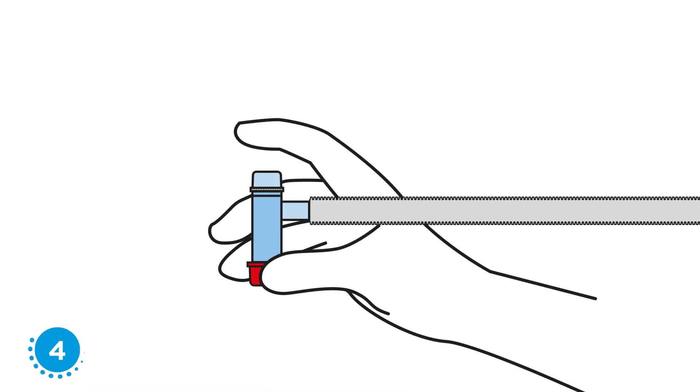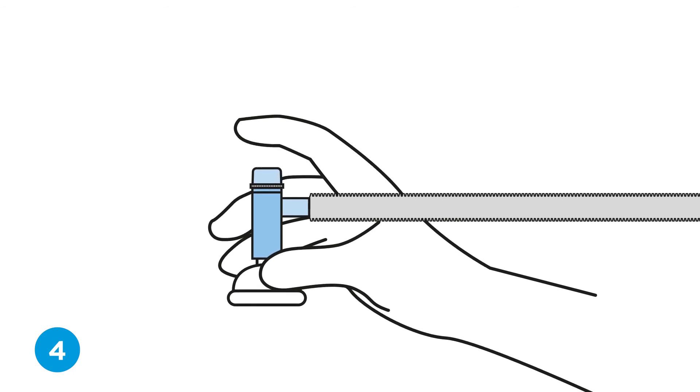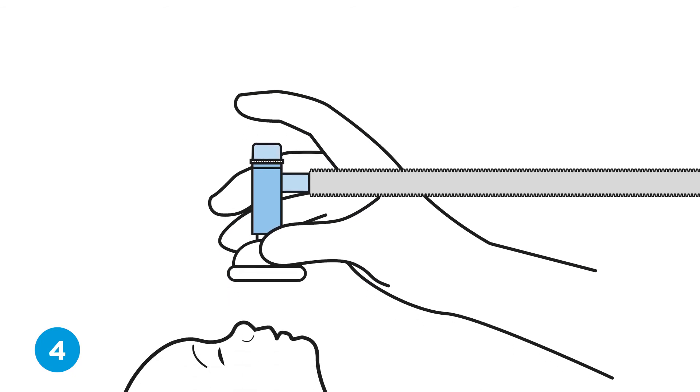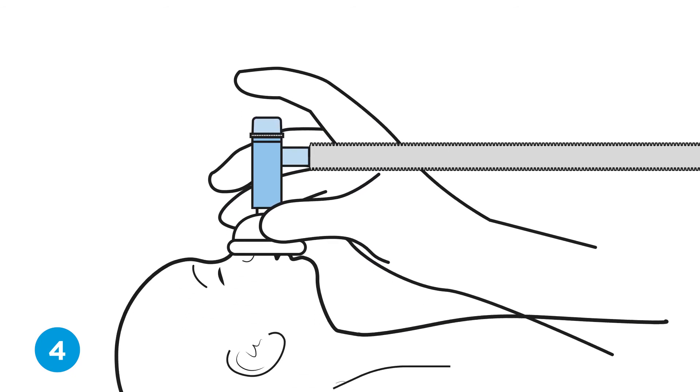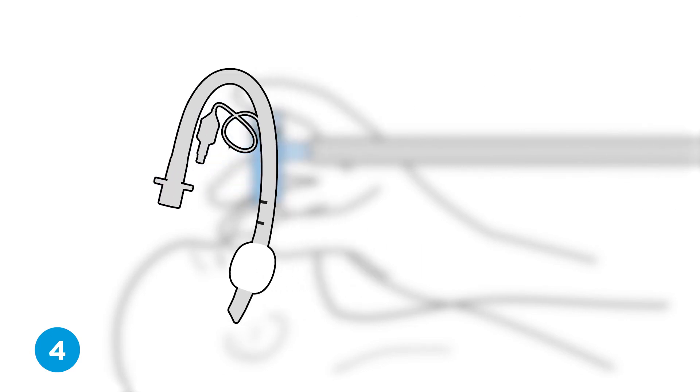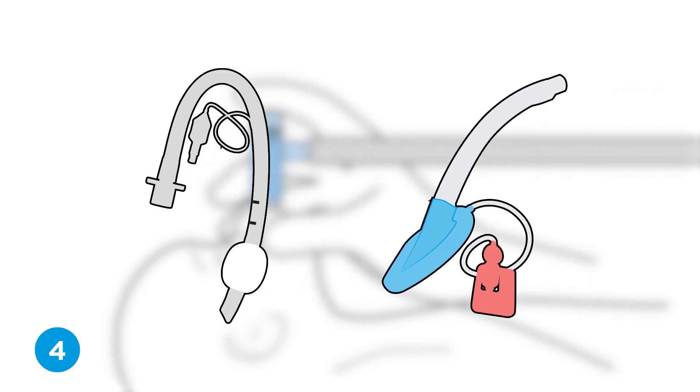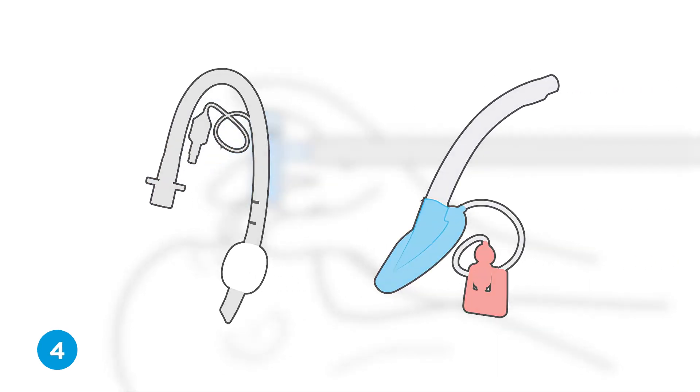Step four, connect patient interface. Remove the red cap from the TP circuit. Fit the neonatal resuscitation mask to the T-piece and place over the patient's mouth and nose. Or, fit the T-piece to an endotracheal tube or laryngeal mask airway.